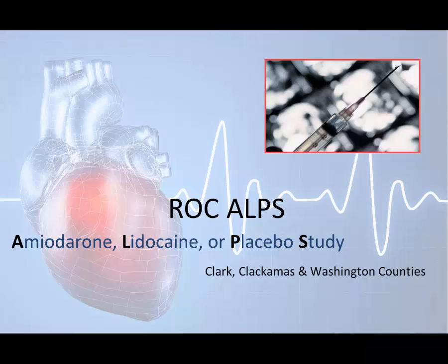Do a mega code with your crew, an ALS mega code. Make sure you go over the switch and that all the EMTs there are familiar with how to use a monitor. Be aware of your compression rate. Use the metronome, the CPR button, to give you the timing on that. That's actually important, because most times compressors will tend to go a little bit fast. So go through a mega code with your crew and get comfortable running the cardiac arrest call.